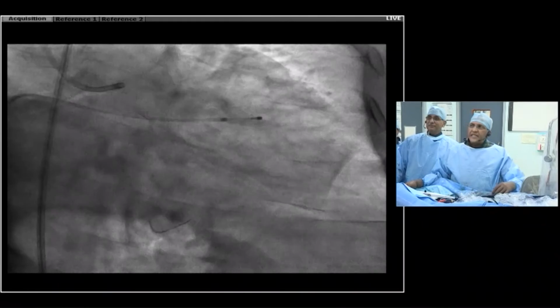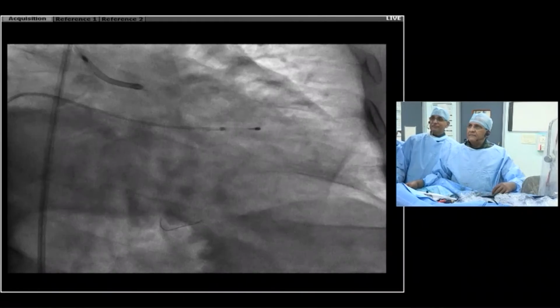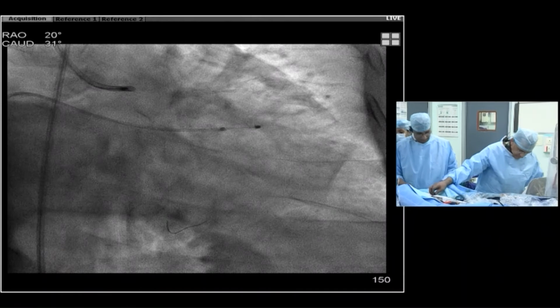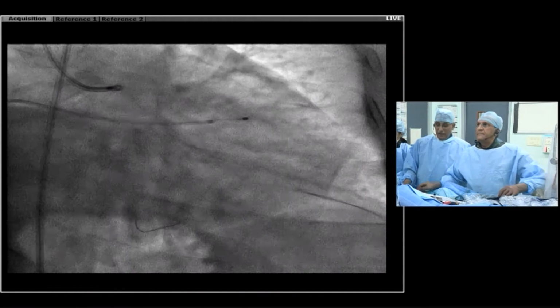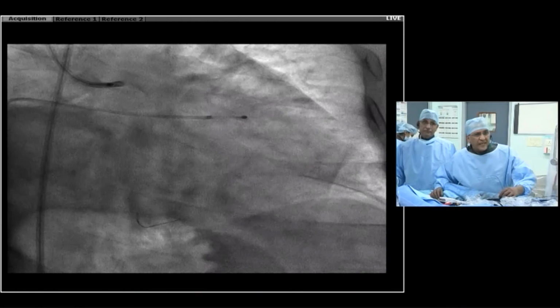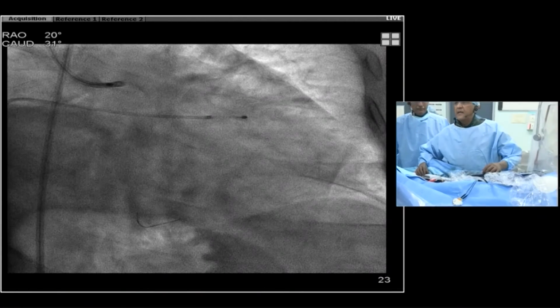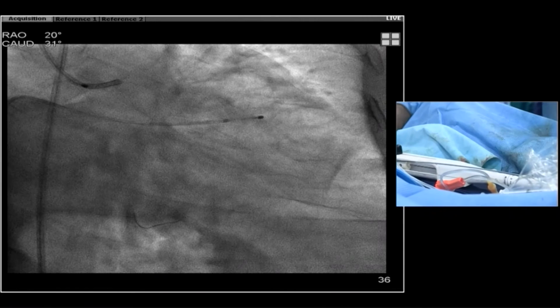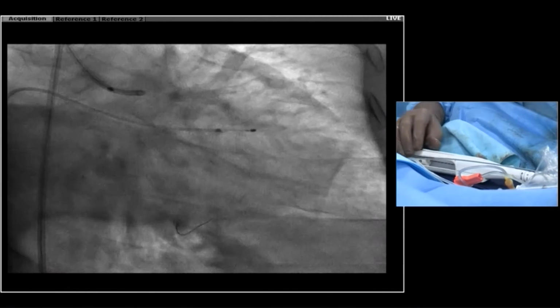So you intermittently just take a peek, maybe. Okay. Ready? Yep. Okay, let's go. Platform at 180. Dyna. Yeah. Platform 180.